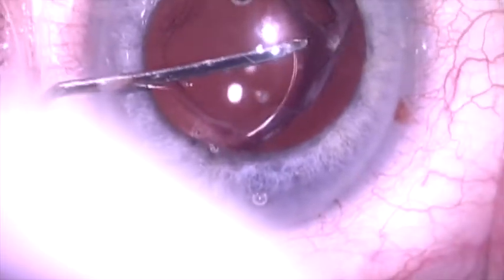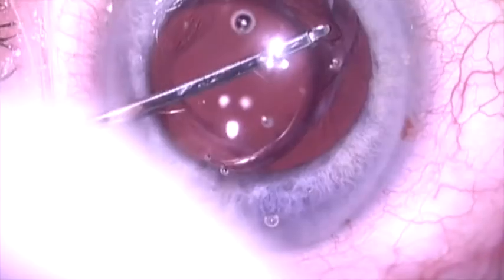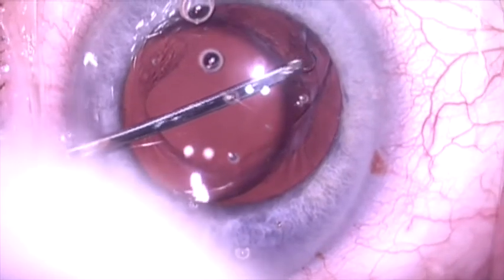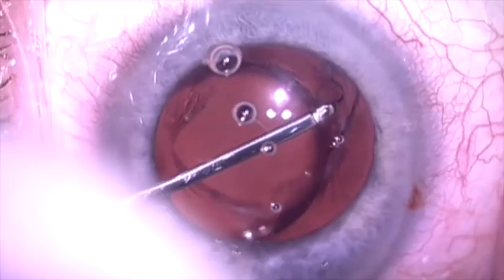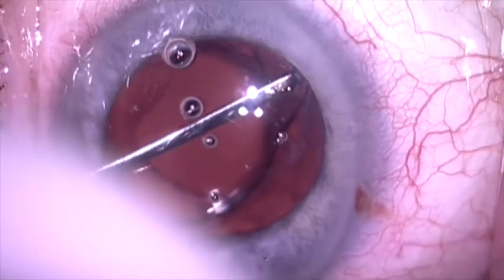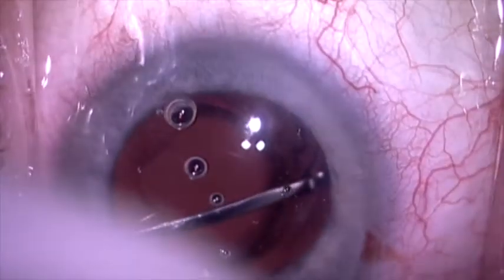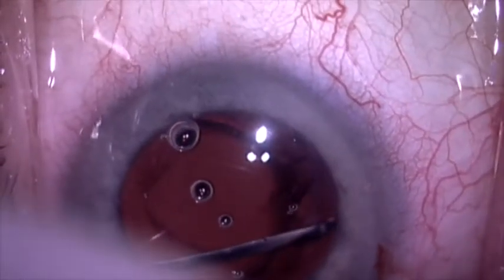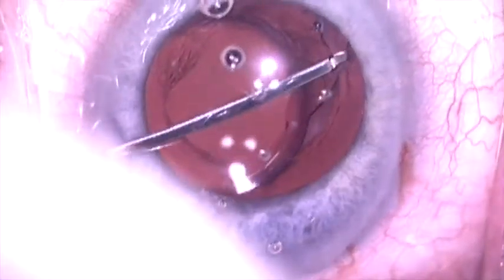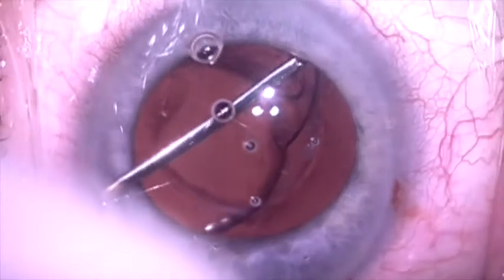Here we're going to attempt to dissect open the capsular bag. I placed a viscodilation cannula, which is actually a spatulated 26-gauge LASIK cannula, over the haptic where I can sneak in under the anterior capsule, and I'm going to inject and disperse the viscoelastic here, trying to reopen the capsular bag by sweeping right and left as I inject the viscoelastic.